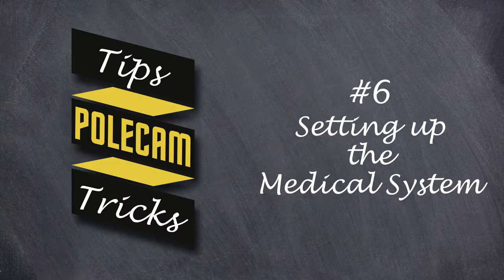Welcome to this guide to rigging the Polcam medical system. Please note that not every rig is the same — different customers may have different configurations depending on their requirements.